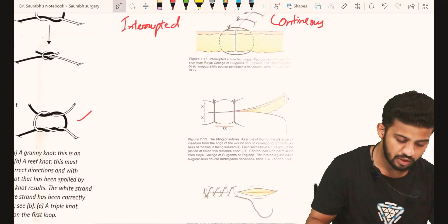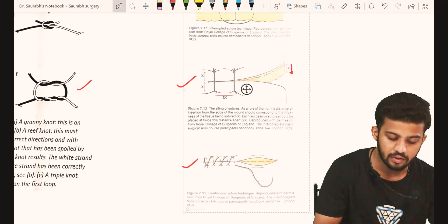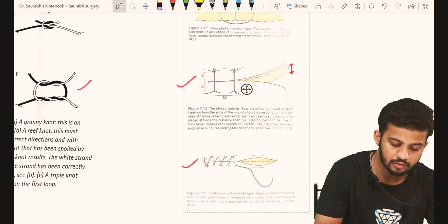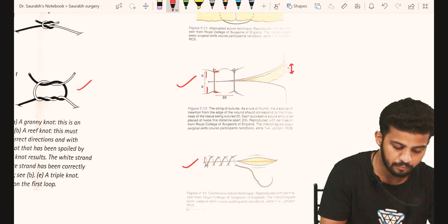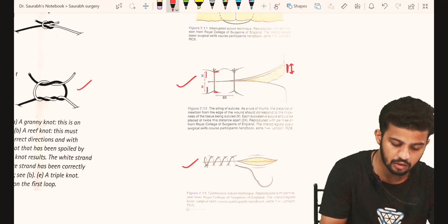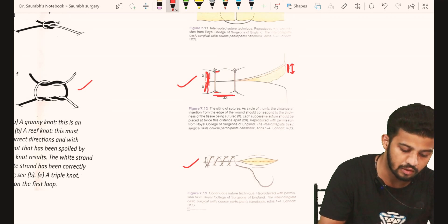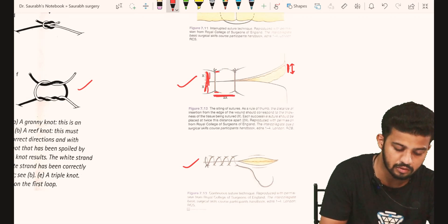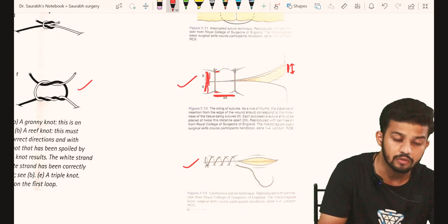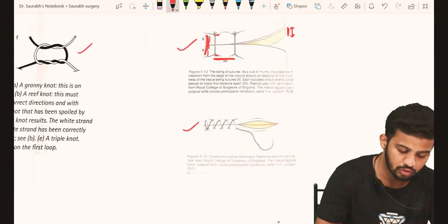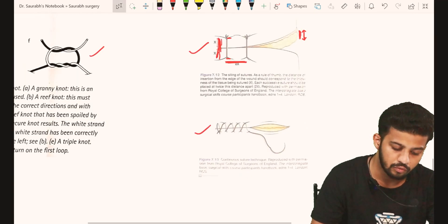In interrupted sutures, there is one golden rule from Bailey: the thickness of the skin is X. When we stretch the skin, the distance from the edge to the stitch on each side should be X and X, equal to the skin thickness. And the distance between two stitches should be 2X. That is the rule of X for placing interrupted simple sutures. In continuous sutures, we just continue the stitches, and I will show you shortly how these stitches are placed.